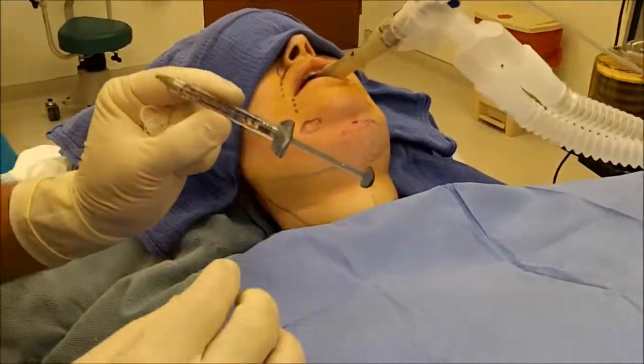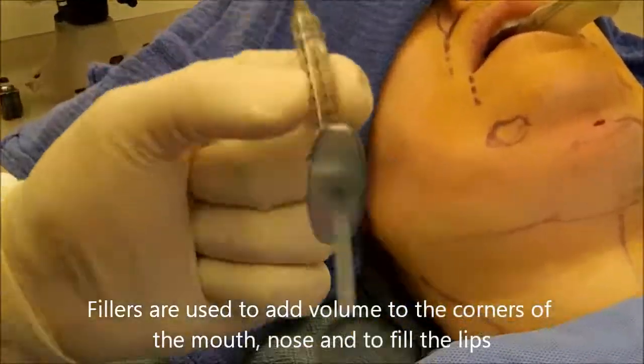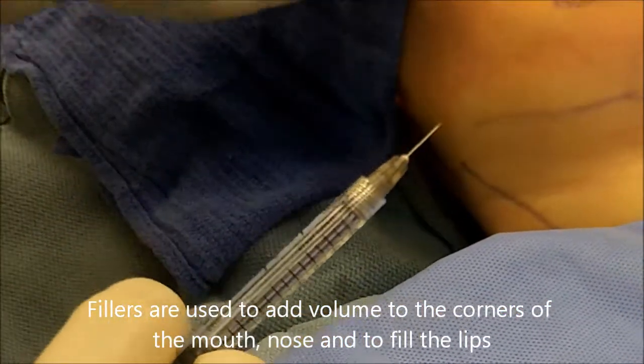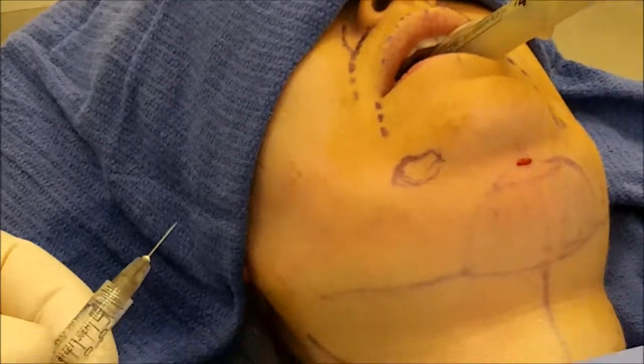I'm going to demonstrate Juvederm. This is a vial of Juvederm Ultra Plus. It comes with one full syringe and it's a hyaluronic acid. It's great for the nasolabial folds and for the lips, so we're going to use it like that.